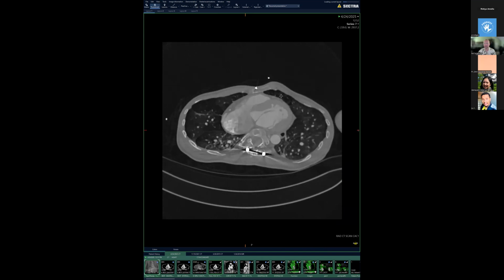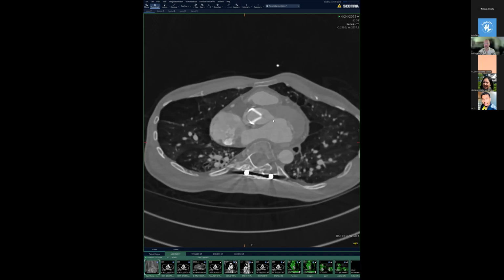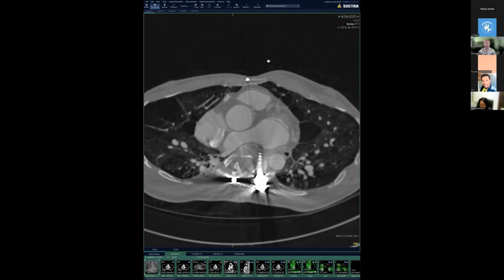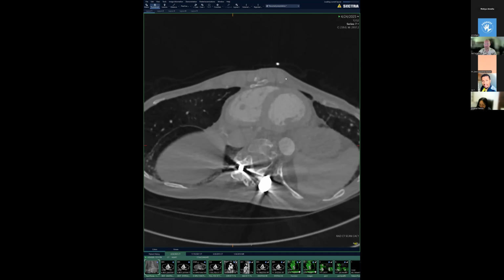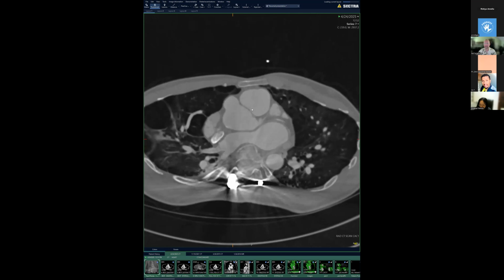And certainly you can already see that there's a mechanical aortic valve in this patient. So the patient already had their aortic valve replaced. I don't remember exactly what the reason was, whether it was a bicuspid valve or just a very dilated aortic root, and therefore the aortic valve was very regurgitant. But certainly the patient has significant chest wall deformity, and the surgeons replaced this patient's aortic valve.